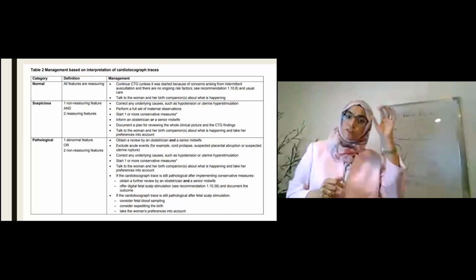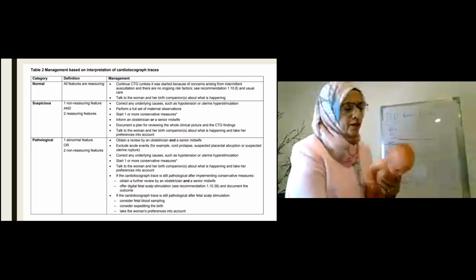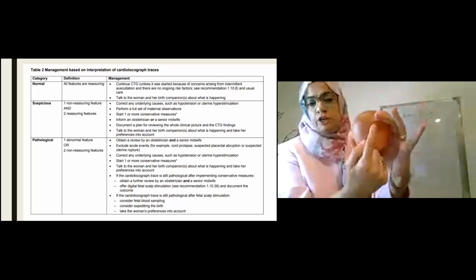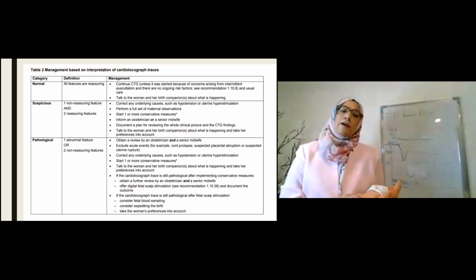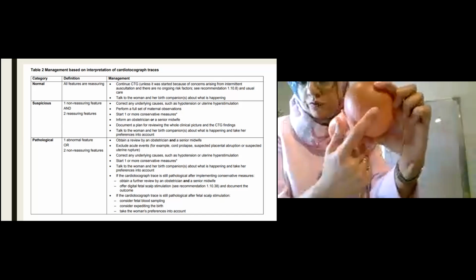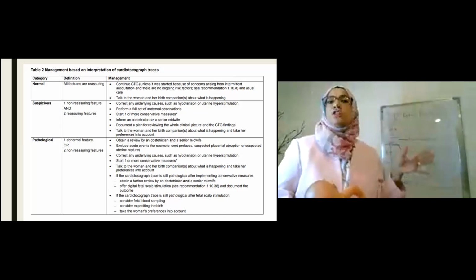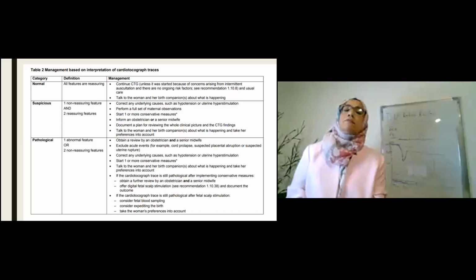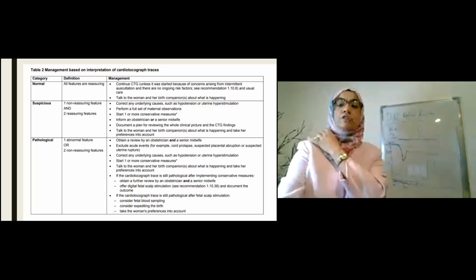That means you have to go with a special instrument and reach through at least a 5 centimeter dilated cervix. You can scratch the baby's head, take a little sample, just like the diabetics check their blood sugar. You can check the oxygenation level on the vertex of the baby, and tell the mother that despite the CTG, the decelerations, the baby's fine. Don't worry. And if you cannot do that, please deliver this baby with an emergency cesarean section with a pathological CTG.